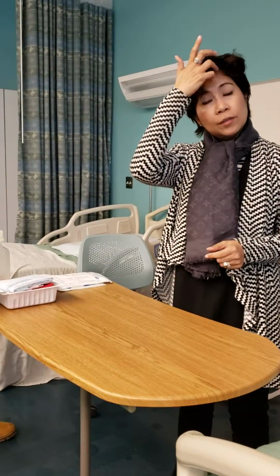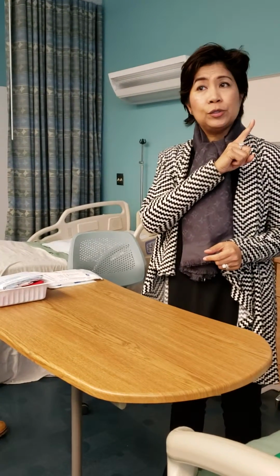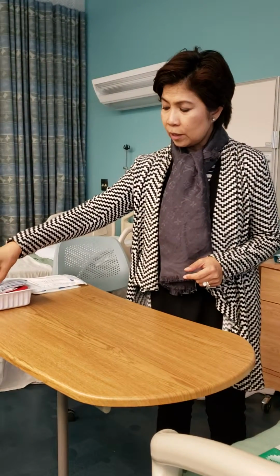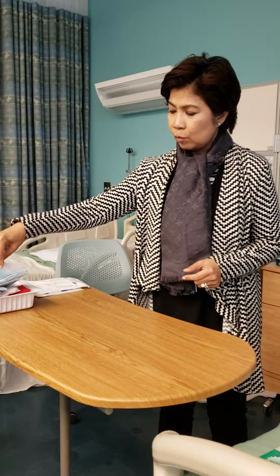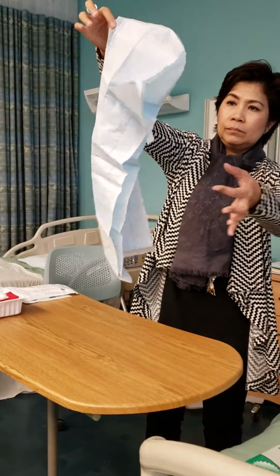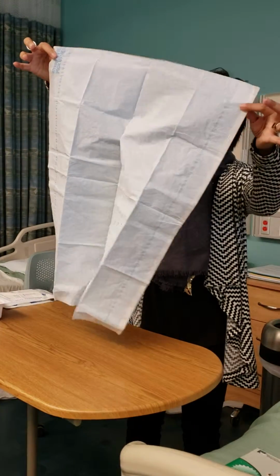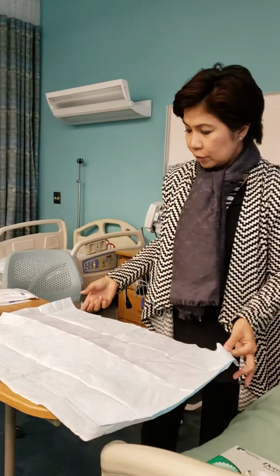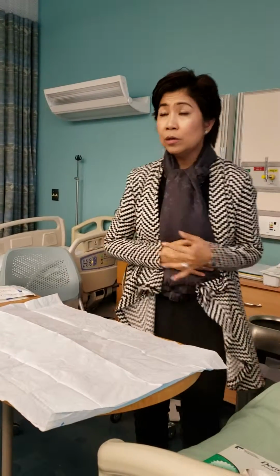Okay, so now the acceptable border is 1 inch. It's not 2 inches, it's 1 inch. You can only touch 1 inch of the border. If you touch more than that, then you've broken your sterile field. So just touch 1 inch of the border. Just 1 inch. Make sure you're not touching any other part, and you're not touching it to your clothes.